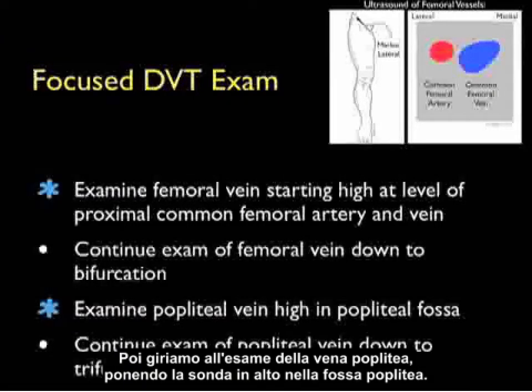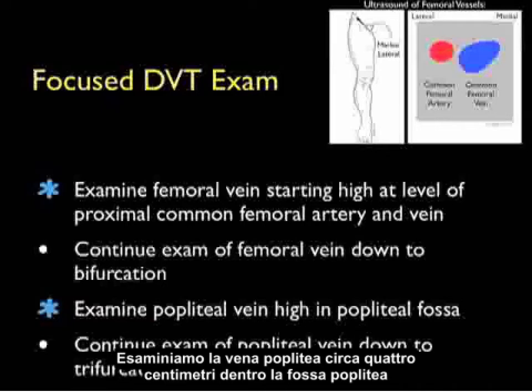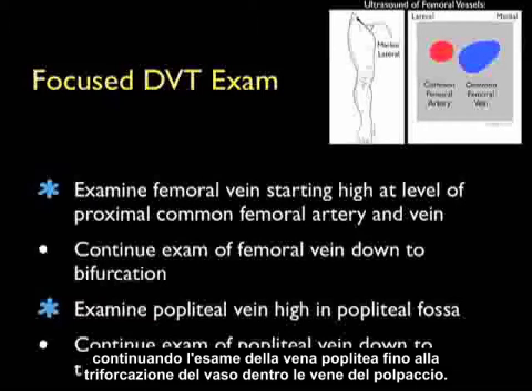We'll then turn to examination of the popliteal vein, placing the probe high within the popliteal fossa. We'll examine the popliteal vein about four centimeters within the popliteal fossa, continuing the exam of the popliteal vein down to trifurcation of the vessel into the calf veins.